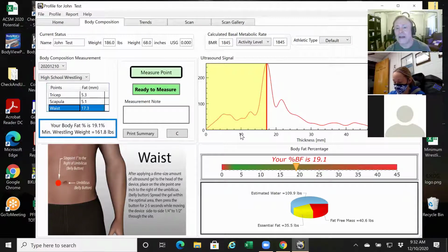The default setting simply tells the software to look for the first strong peak beyond 10. And in my case, it picked it out because people that have excess fat, trust me, they're going to be beyond 10 millimeters. I hope that provided a little bit more clarity as to how lean and default affects this thing. At the end of the day, guys, lean and default really don't matter as long as you're analyzing this graph correctly.